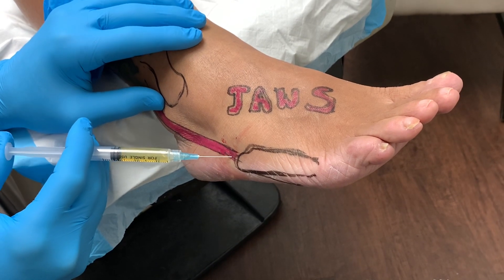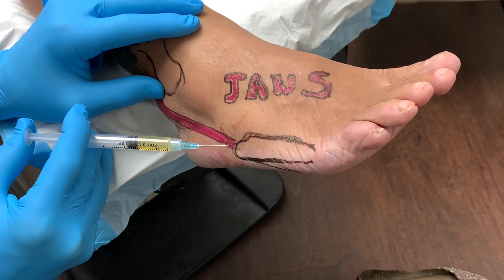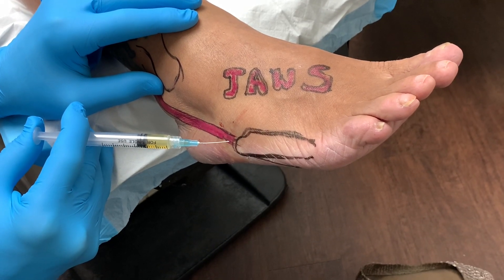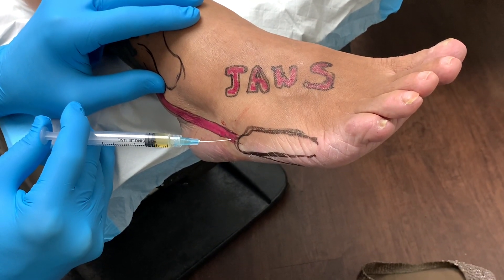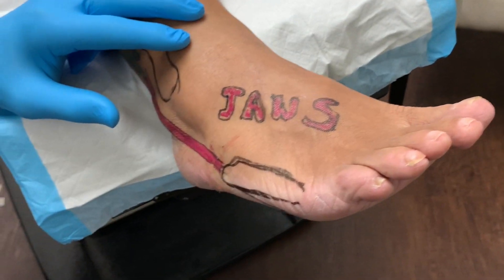Now we're going to go right through here. And we're all done. On a three, two, one — and we're done. We're all done.